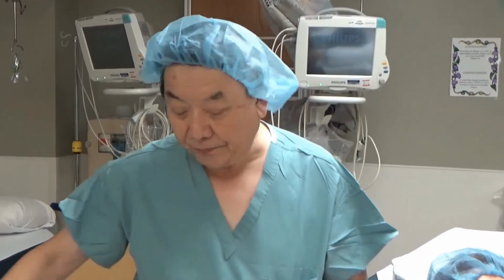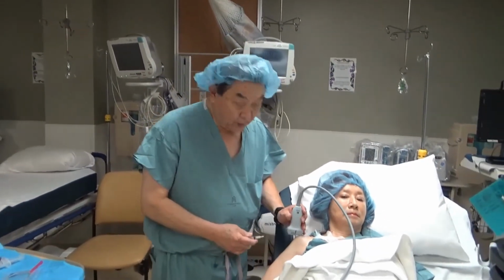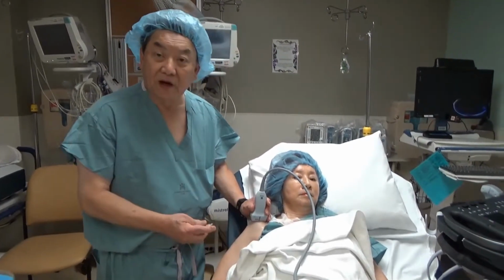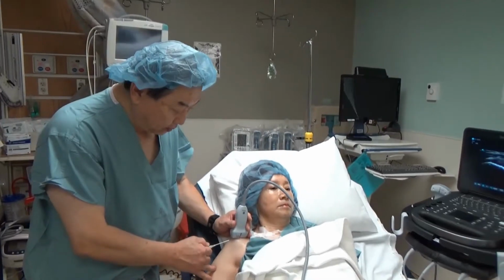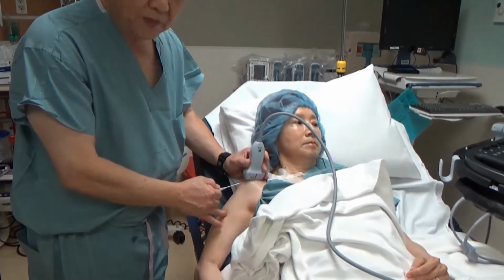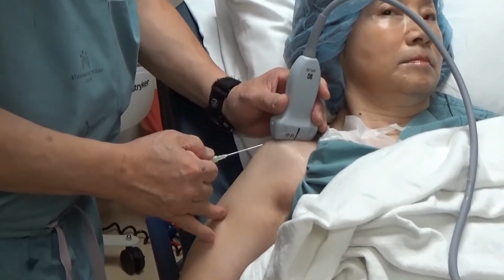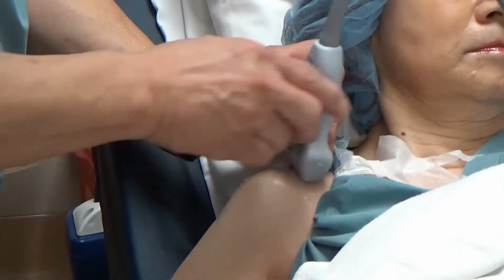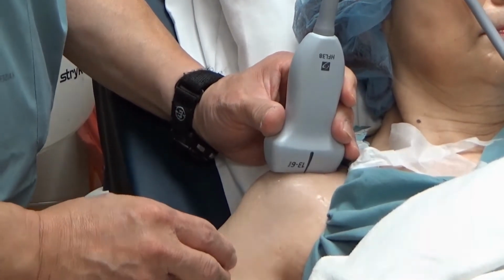Now, finally, after we have completed our fenestration, we go and inject the bursa. So here I'm going to simulate this procedure again, and then we will take our needle attached, and we will go into the bursa, and then we will inject. Let me show you this picture here.